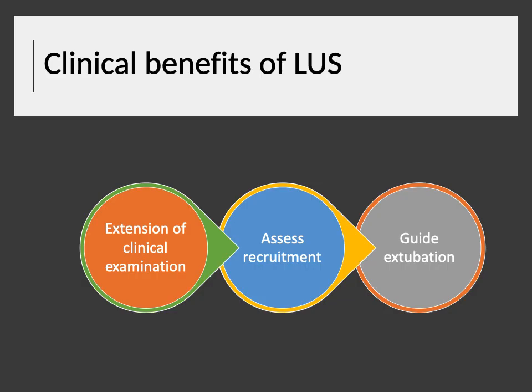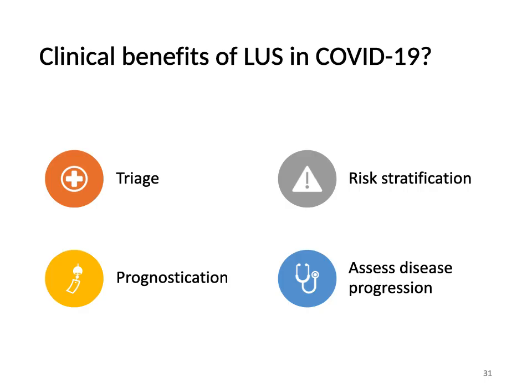So clinical benefits of ultrasound in COVID, it could be used as an extension of clinical examination, as I believe, and therefore it could assess recruitment, and it could help also as one of the additional tools to guide the patient readiness for extubation.